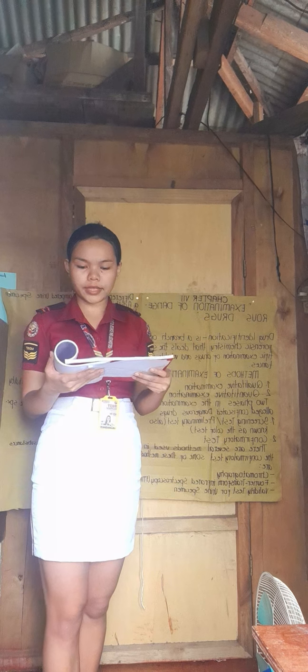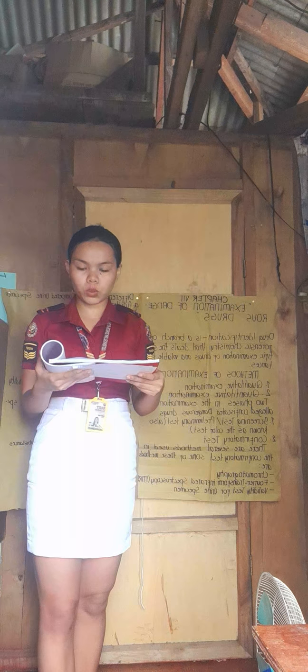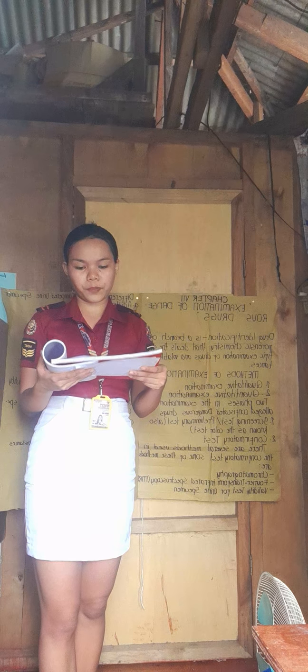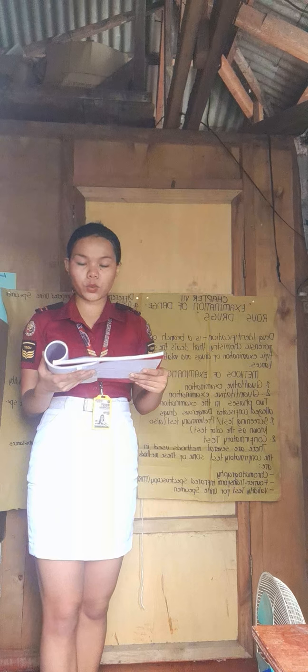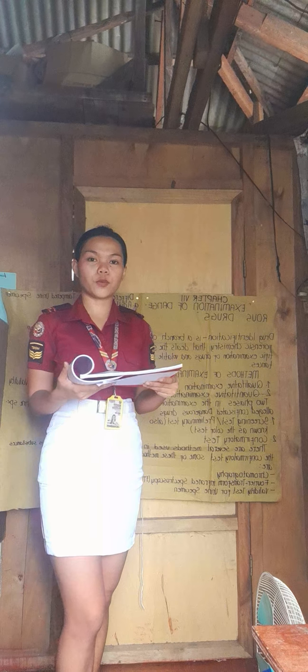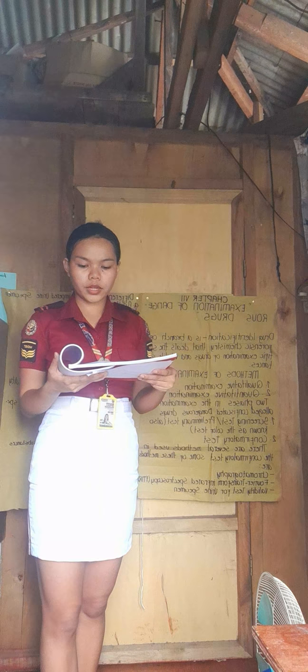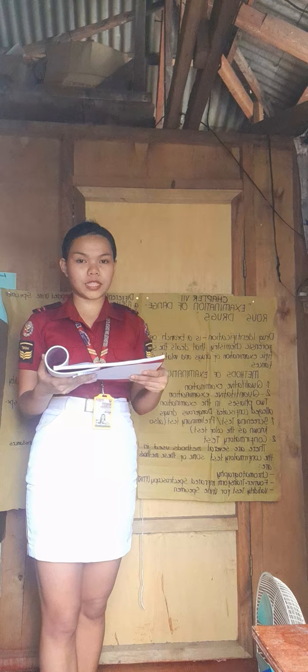For cocaine: the cobalt thiocyanate test or CT test equals blue. Scott test or modified CT test: reagent 1 equals blue, reagent 2 equals pink, and reagent 3 equals blue. The Wagner test equals brown, or a specific test for cocaine.